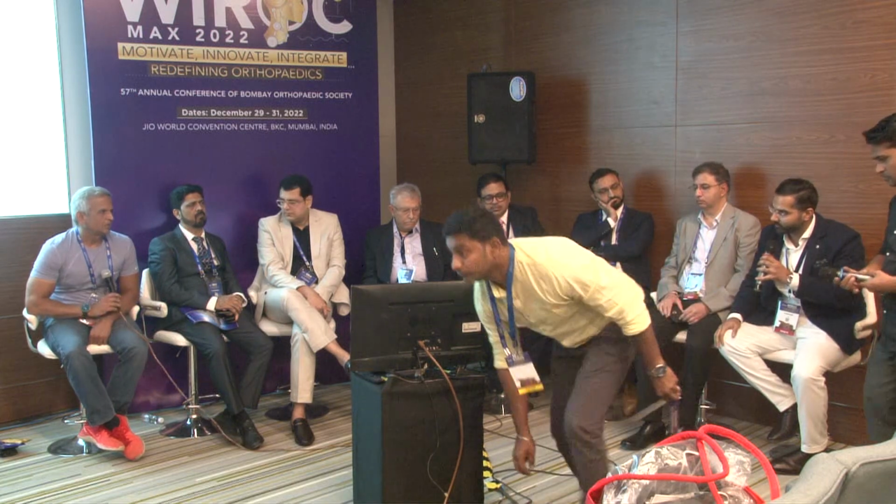So when I came back to India, I had a patient with a BMI of about 40. I was too zealous to do the anterior approach. I did it on a routine table, and I had that complication because I was putting the stem into varus. My hand wasn't down. So that was a technical inadequacy and not something that the approach really does. Approach specific. It was my fault.